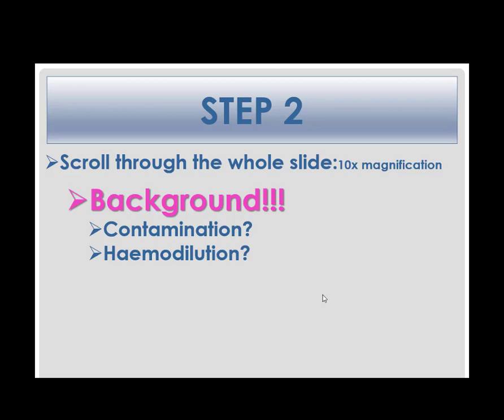The next question you should ask yourself is whether there is any sign of necrosis. Even if it is not a primary reason for performing the cytology, it is an important element, as the presence of necrosis will stimulate inflammation. So identifying it is essential.